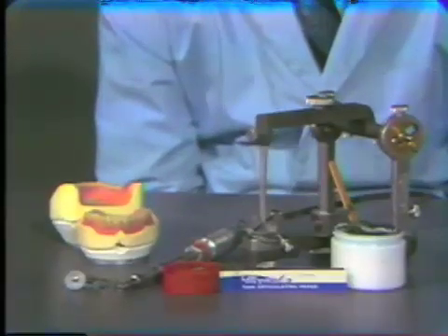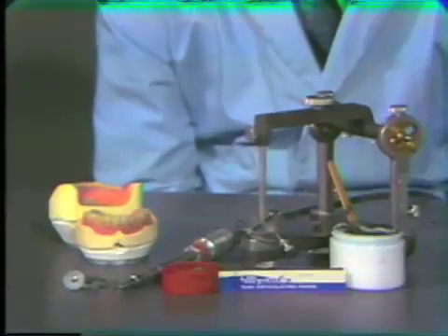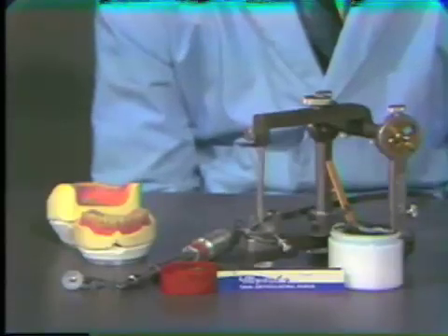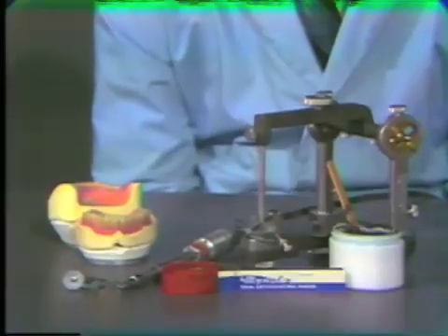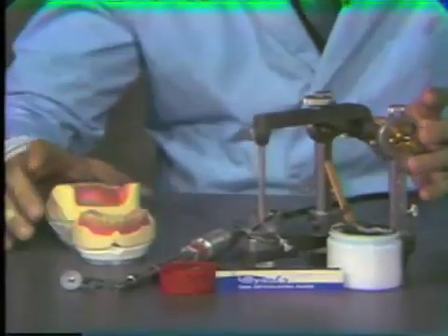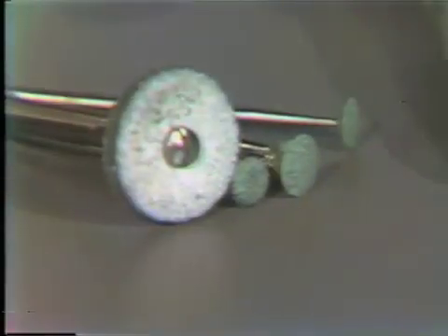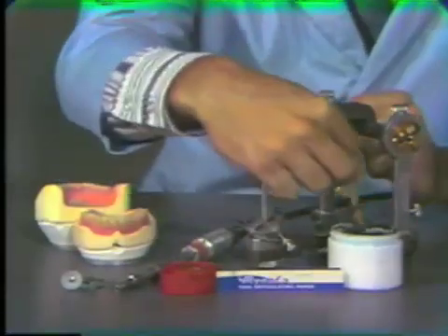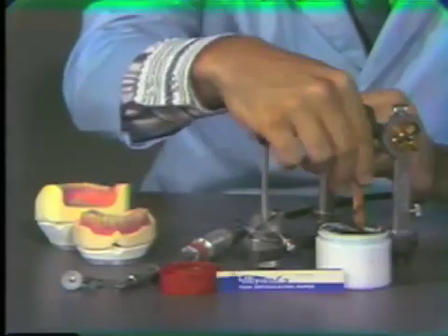Usually during the processing procedure, minor tooth movement occurs. Therefore, it is necessary after processing to correct this inaccuracy. The materials needed to do this are your articulator, the processed dentures, a selection of green stones and a heatless stone, a straight handpiece, Madam Butterfly articulating paper, the blue carbon inked paper, and a mixture of some abrasive paste.